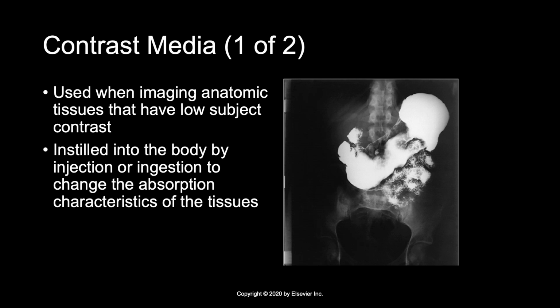The quality of the image depends on a multitude of variables. Knowledge of these variables and their radiographic effect assists us in selecting the exposure techniques to produce the radiographic exams.